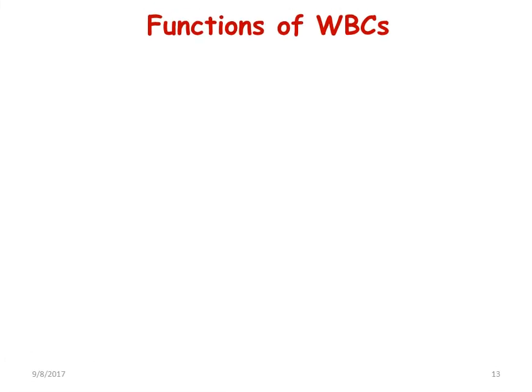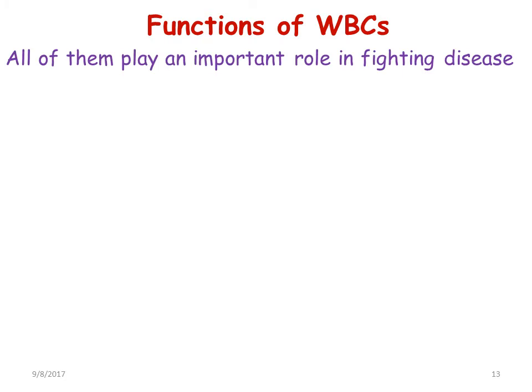Let's look at the functions of the white blood cells. Functions of the white blood cells is important because in disease conditions you find that these cell counts will change. All of them play an important role in fighting the disease. This is what is important.